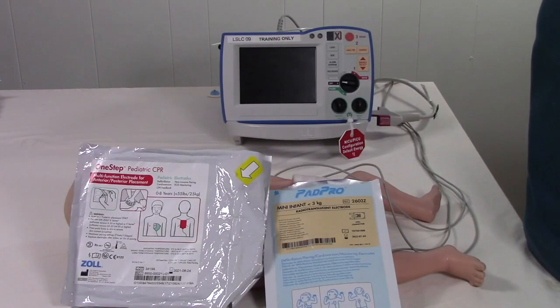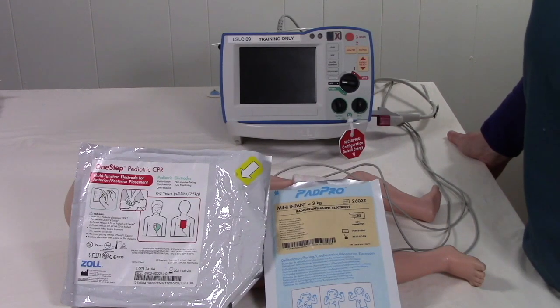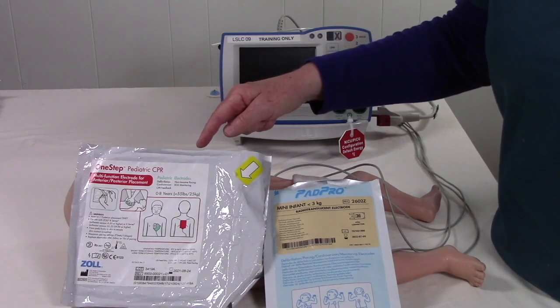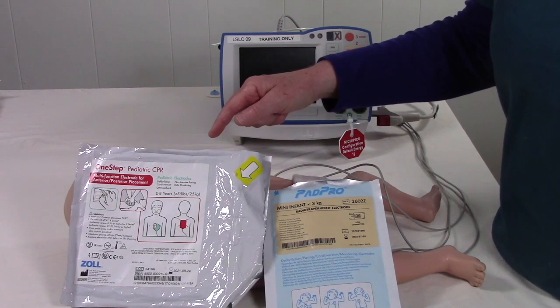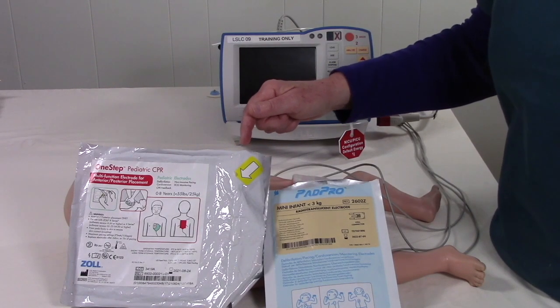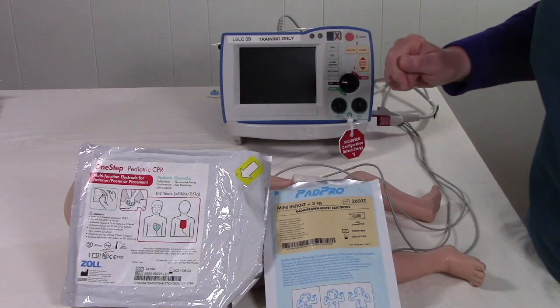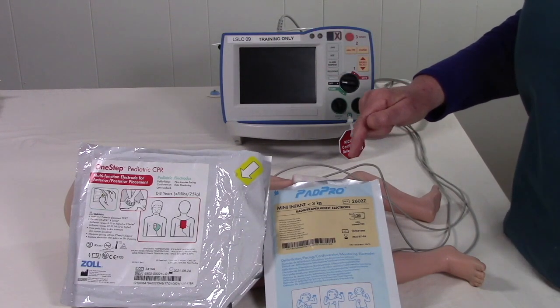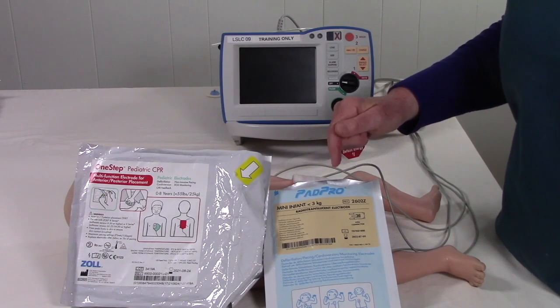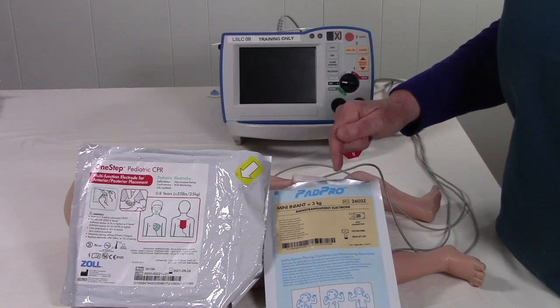When using the Zoll R-Series in the neonatal ICU, you will have a choice between two pads for most infants. The One Step Pediatric CPR pads can be used up to 25 kilos, so they will work for any infant in the neonatal ICU. However, we also have a smaller pad — the Pad Pro Mini Infant Pad — but these can only be used in infants who are less than 3 kilos.